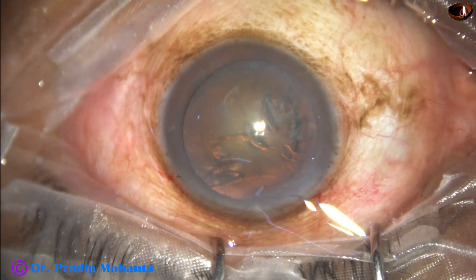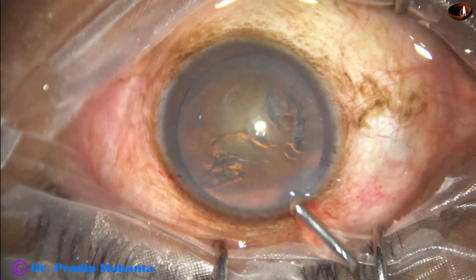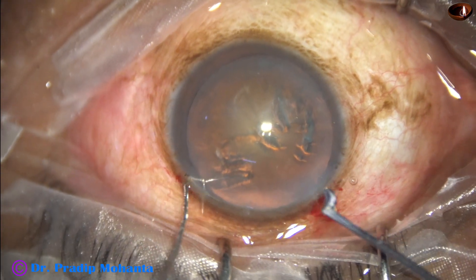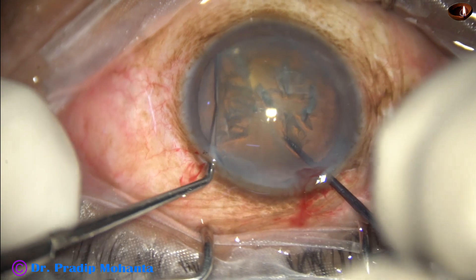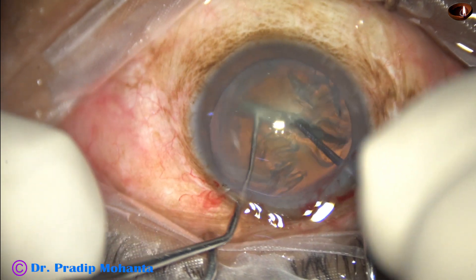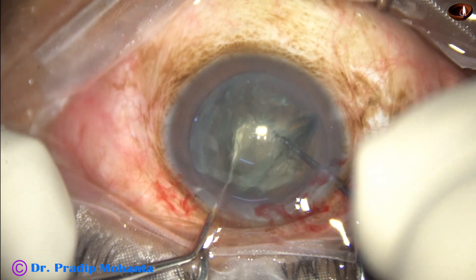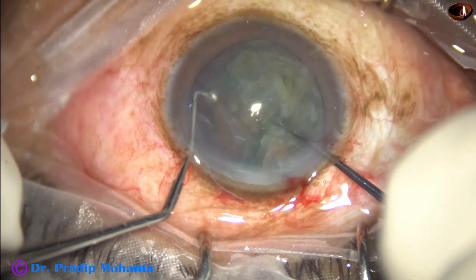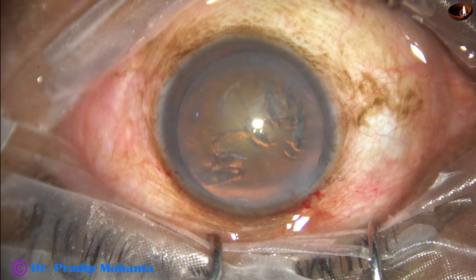Now the anterior chamber is filled up with 2% hydroxypropylmethylcellulose. The pre-chopper goes in the right hand and a sustainer in the left hand. The nucleus is divided into two pieces, then one heminucleus is subdivided into two fragments, and then the other heminucleus.